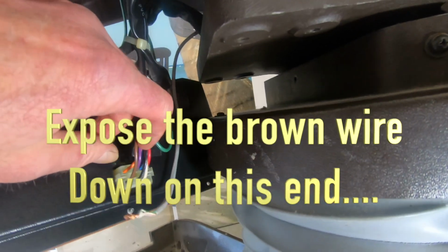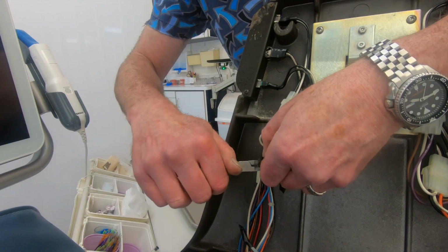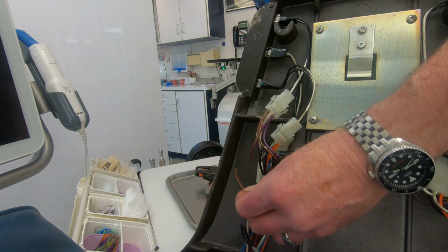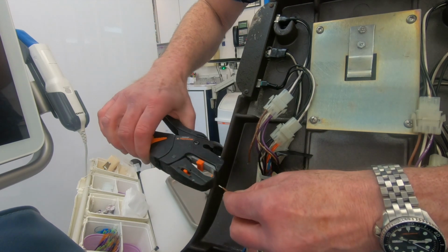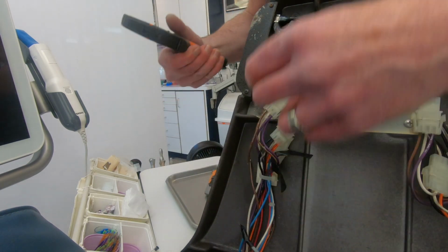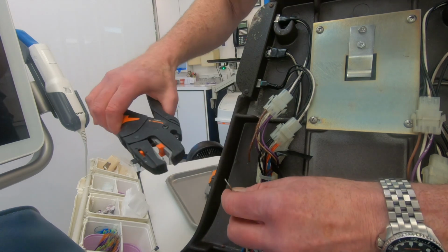All right, I'm gonna cut this and put another wire through there. So as I'm watching this back, the idea was I was replacing the brown wire running underneath the chair. So I really didn't need to connect both sides of that wire together again. All I needed to do was replace that wire. So I really didn't even need to strip this part right there. All I needed to do was connect the switch, which is the top part, to a new wire, and then connect the new wire underneath to the circuit board underneath, but I basically did a three-way up top here for absolutely no reason because I didn't connect it down on the bottom.